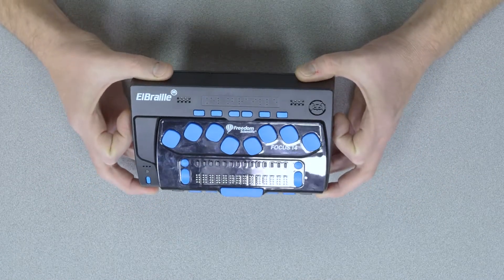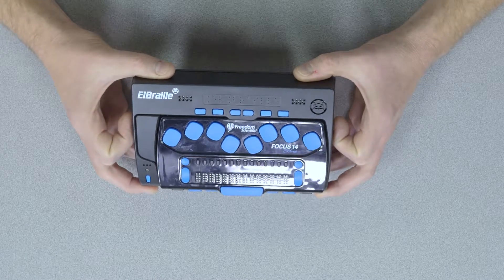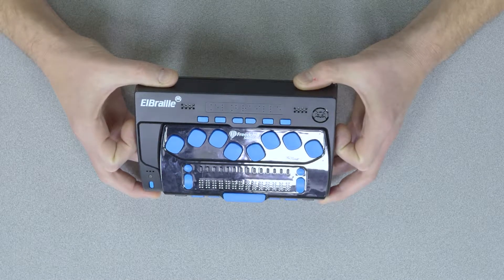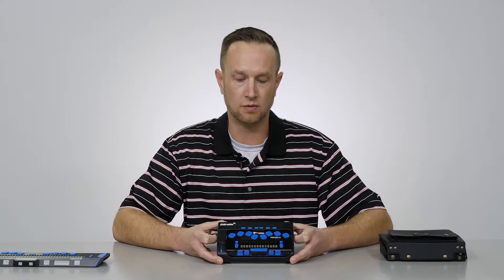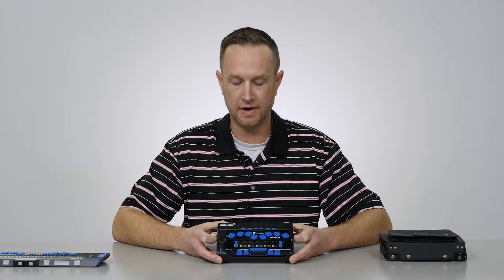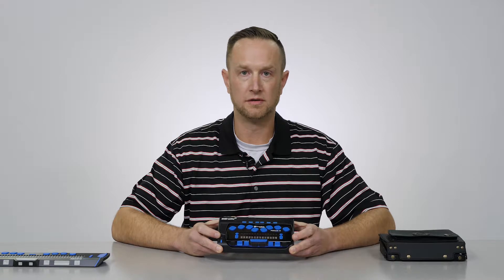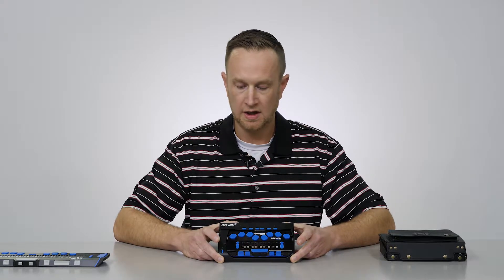So now you have a portable computer, essentially a note taker and refreshable Braille display that can do all of the applications that you would want to do with your computer at home — checking emails, searching the web, anything that you may do with any regular computer you can now do in a nice portable format. Like I said, it runs on Windows 10, it has memory already built into it, you turn it on, it powers up and runs on JAWS, and away you go.